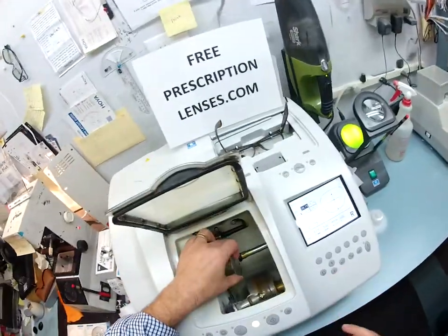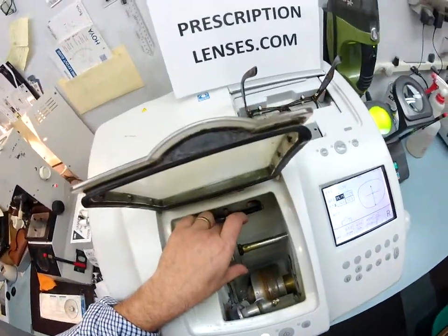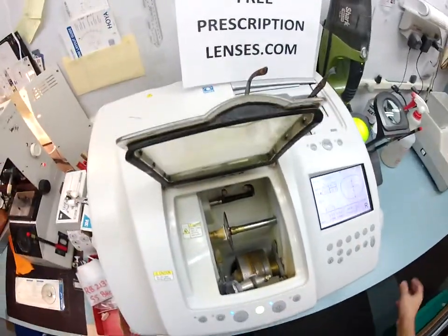I'm going to put this lens into the chuck. Hello, Chuck. I'm sorry, Charles. I don't know you well enough. And I'm going to hit start.